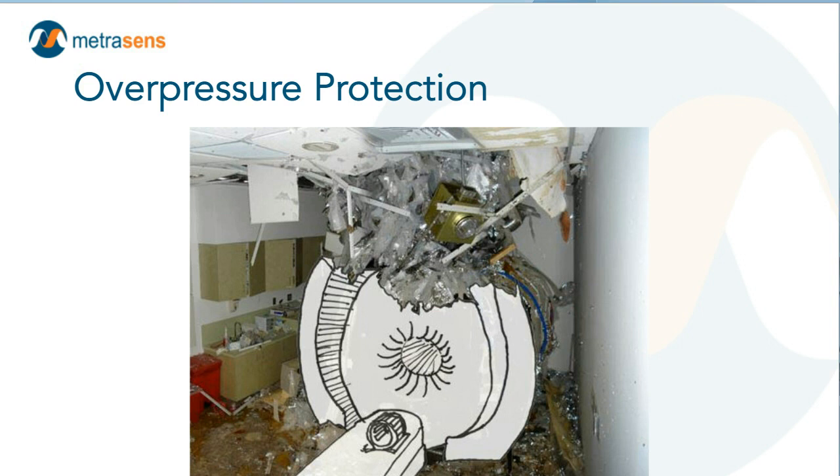Very important to design quench pipes and overpressure in accordance with guidance from your manufacturer. And if your manufacturer has one of those up through the roof turn 90 quench pipe details, you may actually want to do something a little bit better than what they suggest.